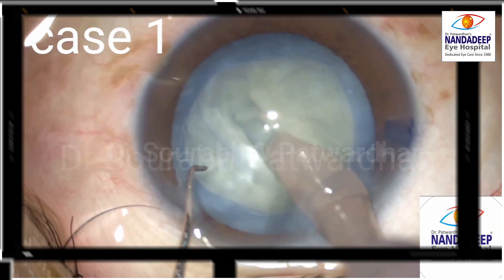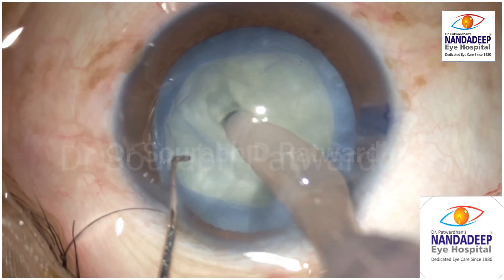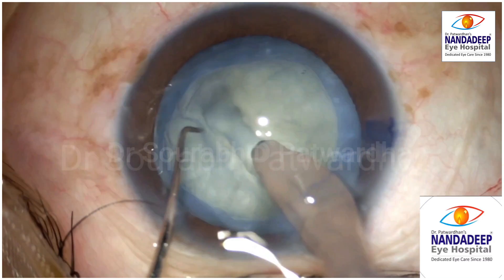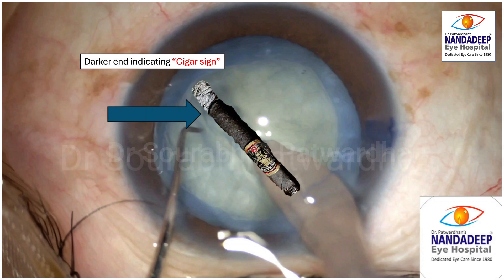There is also a darker cigar sign in cases of mature cataracts where red reflex is not seen. If you look carefully at the color of the trench, the darker end indicates the cigar sign, which means at one end the trench has gone deeper. This is like a cigar with ashes at the end.